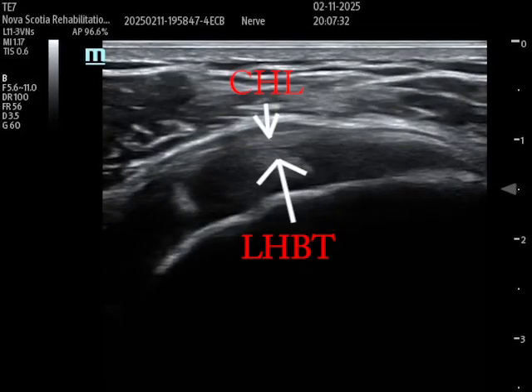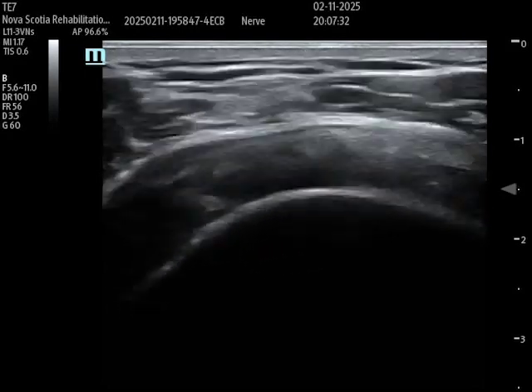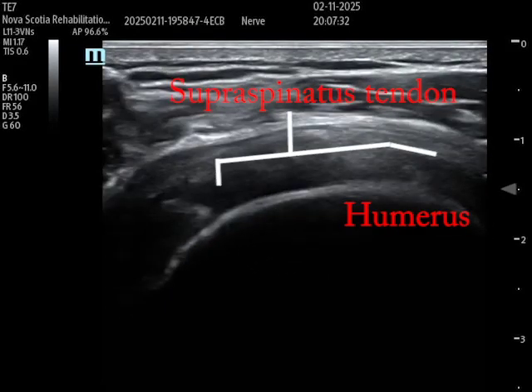There's the long head of the biceps tendon, and the CHL — the coracohumeral ligament — is right above it. You can see a space in between the two. So again, that long head of the biceps tendon is what we're trying to look for with the coracohumeral ligament. When I move the probe even more laterally, I would then identify the supraspinatus tendon.